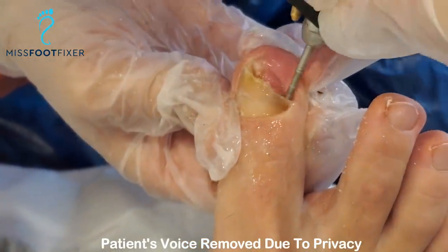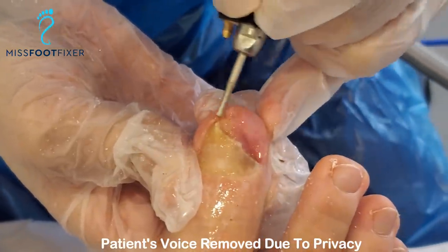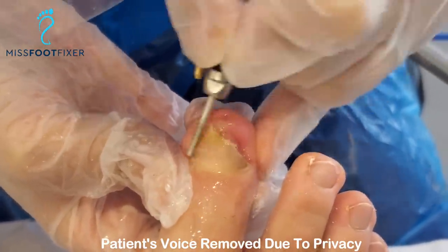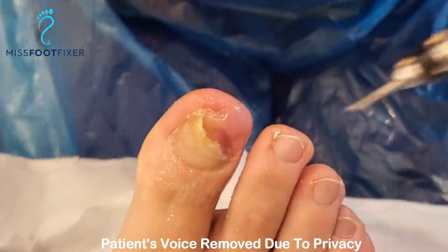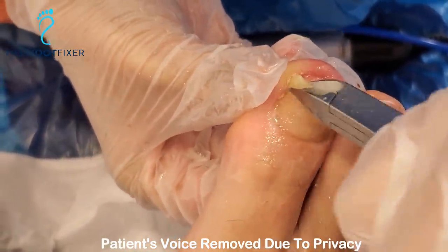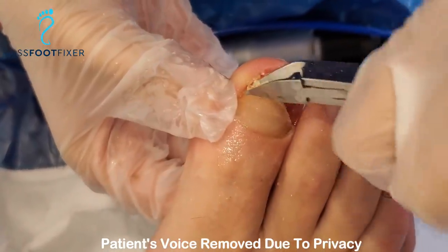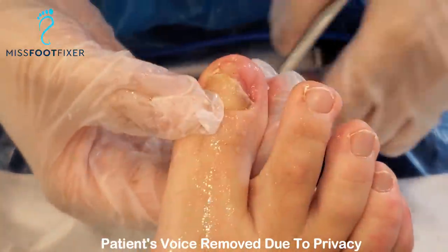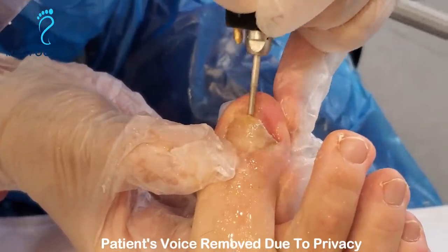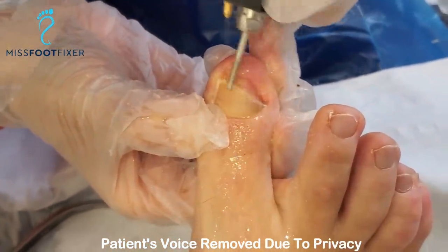We're just going to use a very thin nail file brush to clean everything up. We can see that the nail plate was embedded into the skin of the tip of the toe — we're just going to keep it so curved. I'm going to cut that and keep it as a sample. The deeper, the better.